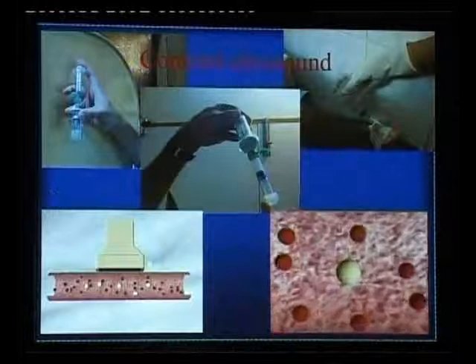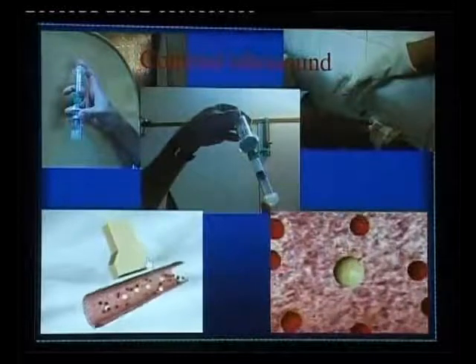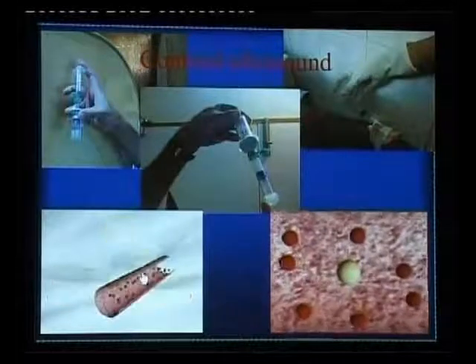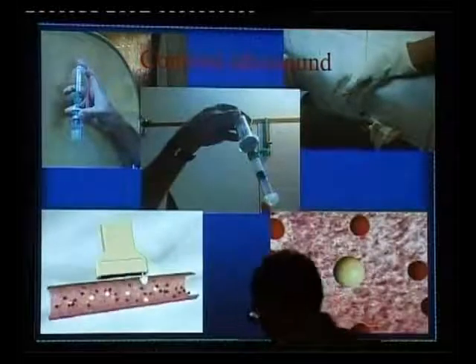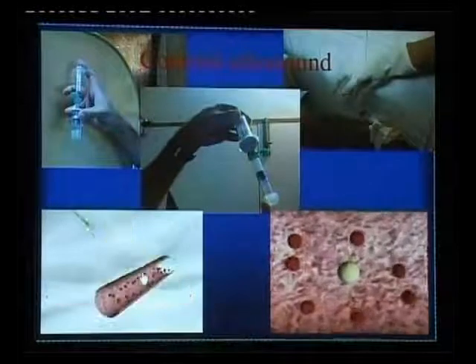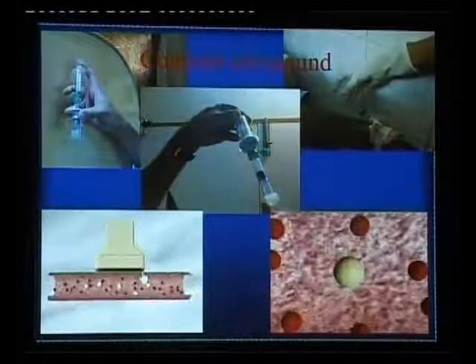fortunately when we interrogate them with the ultrasound probe, that is typically 2 megahertz to 20 megahertz, these bubbles resonate, they oscillate, and because of these oscillations they generate harmonic signals, and we pick up these harmonic signals. These microbubbles also burst when an ultrasound wave hits them, and we can take advantage of this bursting to deliver drugs at a particular site in the body, which is again what is going to happen in the future.